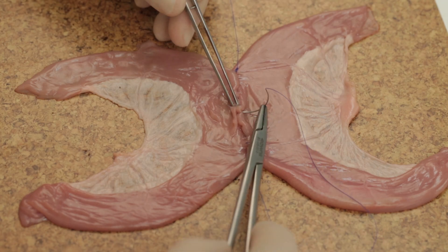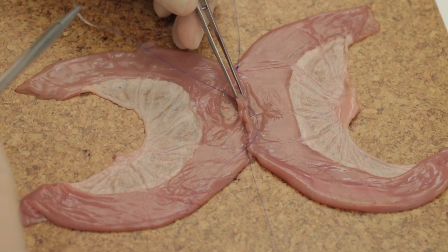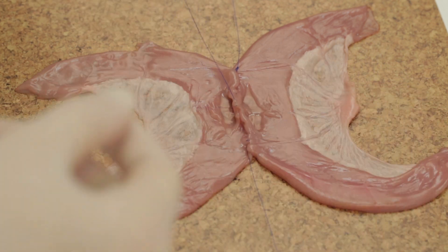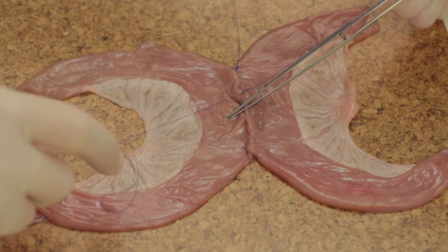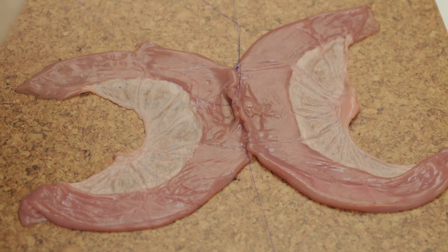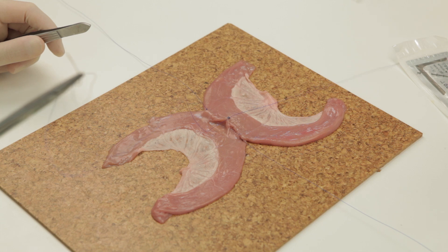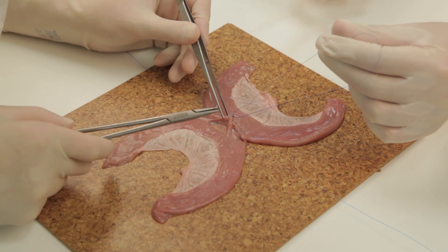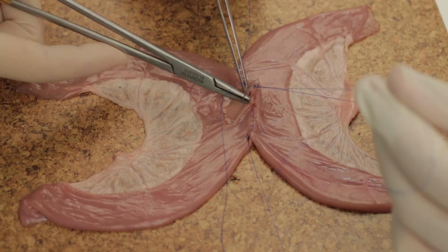Now fashion the posterior inner layer. This begins in the middle of the posterior layer. Again, using a double-ended 2-0 PDS, place an all-coats stitch between the adjacent cut edges of bowel and tie a secure knot. Place a clip on one of the needles. Continue towards one corner with over and over all-coats stitches, taking all layers of the bowel wall.